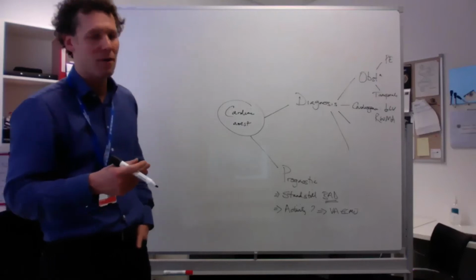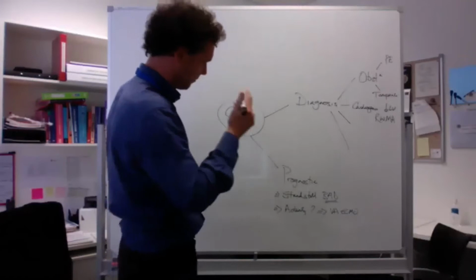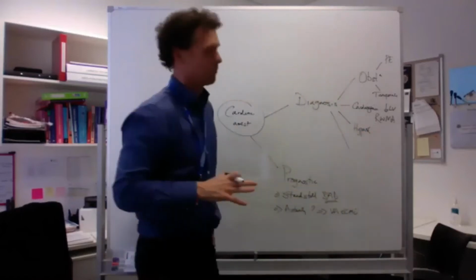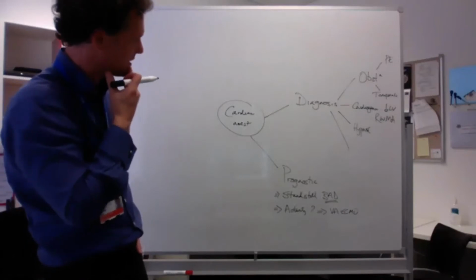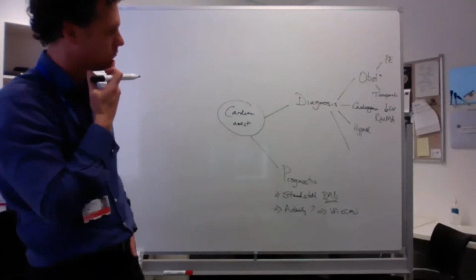Keep going for me, Raymond. Help fill me in some of these gaps. Well, hypovolemia would be cavity obliteration. Yep. It can be difficult to distinguish that from a low systemic vascular resistance state, such as with anaphylaxis. But again, that would be very similar.